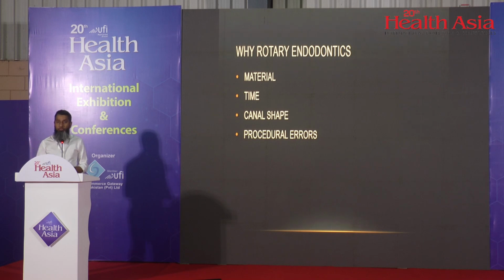With rotary, now we have NiTi files, nickel titanium files, and even in those, with time, there have been advancements, like the gold alloys, due to the change in the metallurgy. So they make those files very flexible. So in areas where previously the manual files would have been difficult to reach, now with nickel titanium files, it's easier to reach those areas of the canals and to shape them properly.